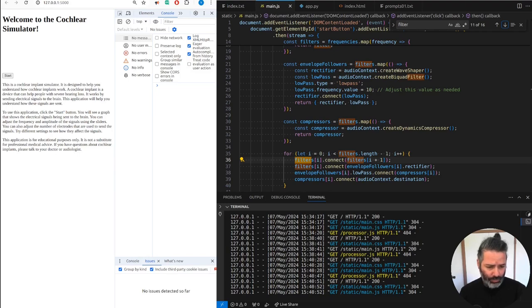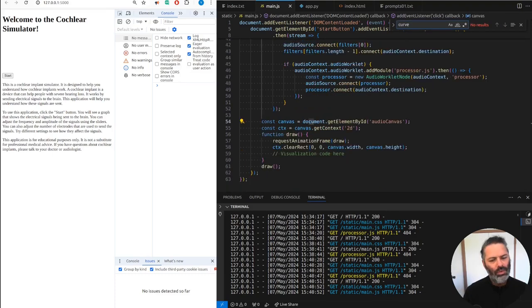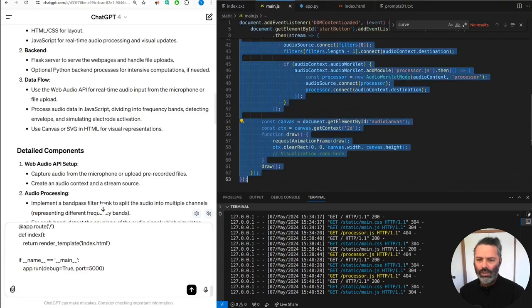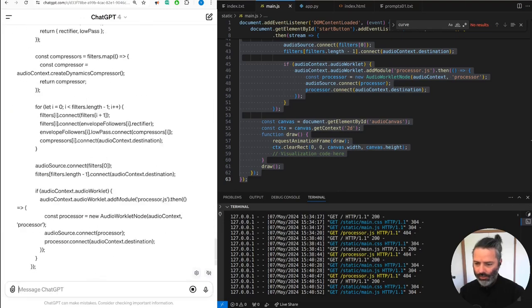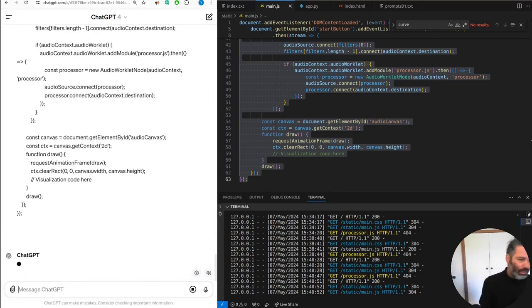It should be fine. How can I detect the envelope of the audio signal using the Web Audio API? Create a gain node, create a wave shaper for the envelope follower. Set the curve for the wave shaper. I'm not sure about that. We have HTML and JavaScript. Just go from here, see what it says.